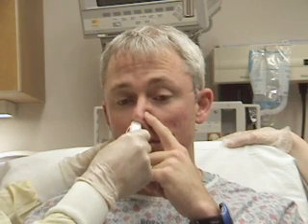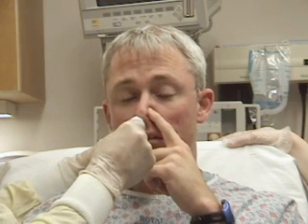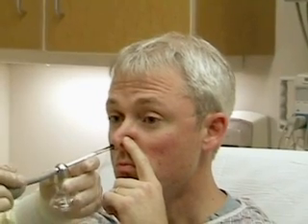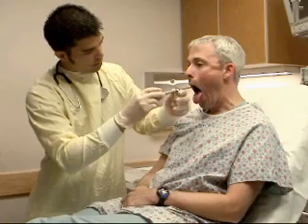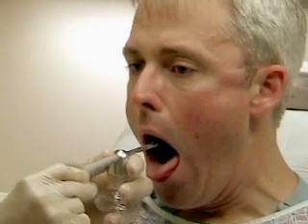Have the patient breathe in through each nostril to assess which side is more patent. Pre-medicate the nasal cavity with a vasoconstricting spray such as phenylephrine or oxymetazoline. Anesthetize the nasal cavity with a topical anesthetic such as 4% lidocaine or topical lidocaine jelly. The posterior oropharynx should also be anesthetized with a lidocaine or topical benzocaine spray. Nebulized lidocaine may also be used.